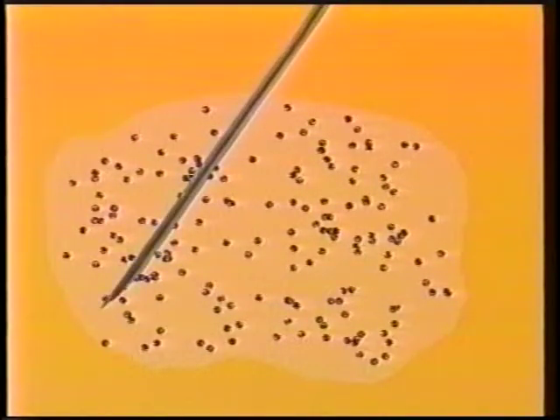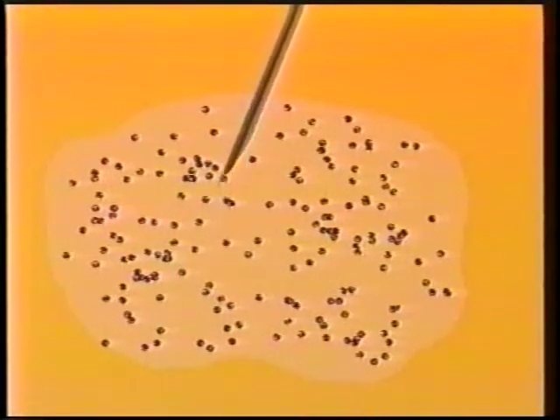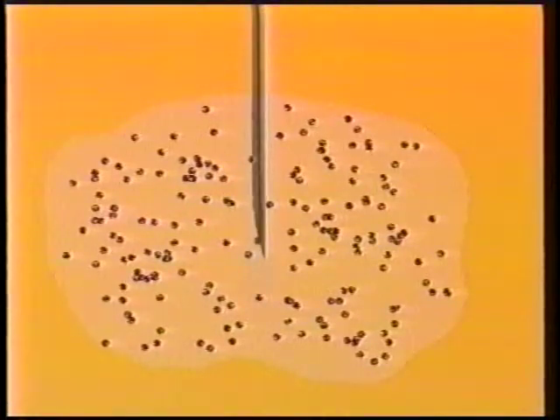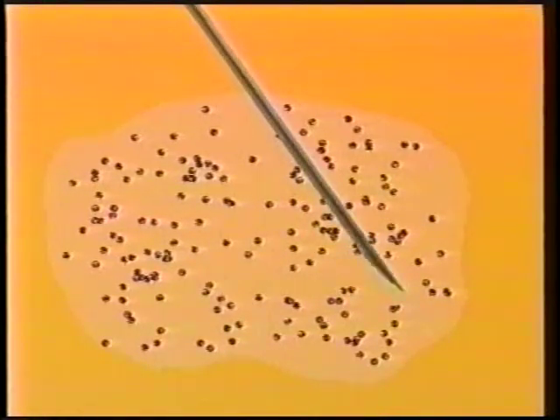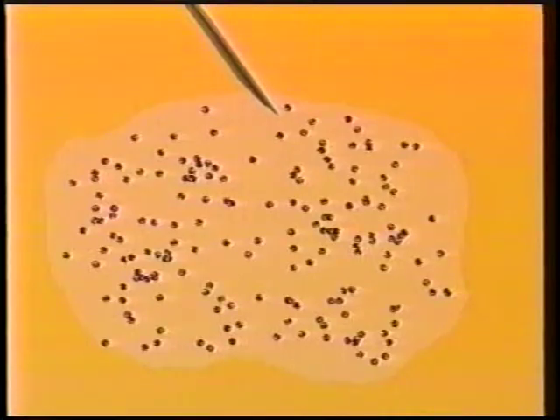This approach is recommended for well-defined masses. In cases of ill-defined areas of increased consistency, sometimes encountered in breast and other areas, it is feasible to gradually change direction of the needle, working through the tissue, creating a fan-like pattern. Because these lesions are composed mainly of fat with little resistance, the needle will travel through easily without significant discomfort or tearing of the tissue.